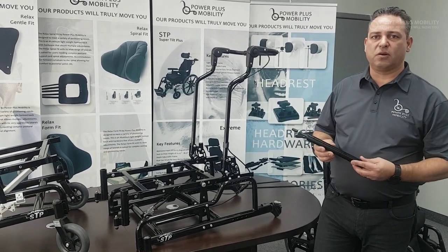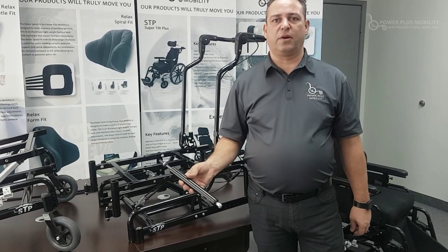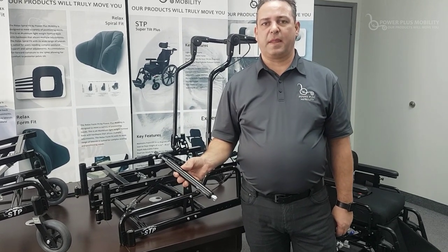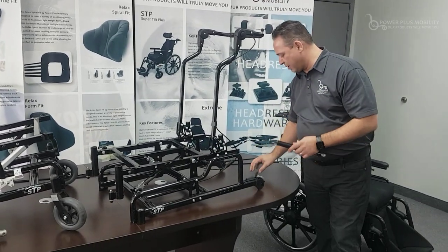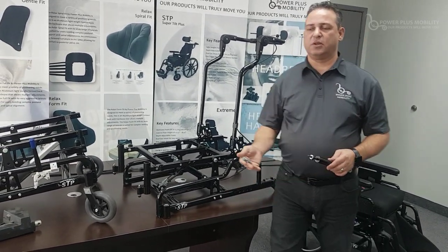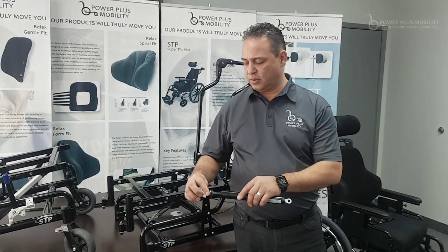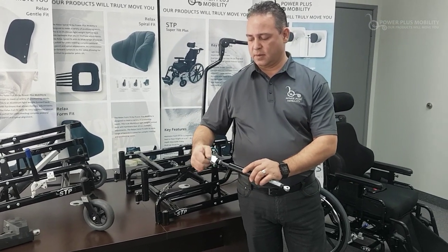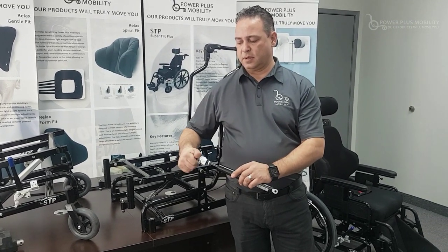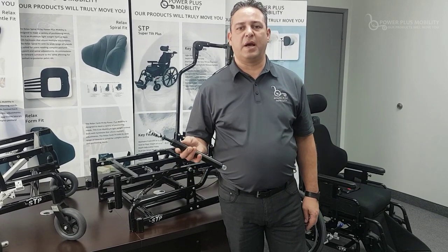Let's take a look at what a cylinder looks like. This is a typical cylinder that we use, and on the cylinder we have a very critical component called the cylinder head. The cylinder head attaches to the cylinder on one side, and once those two components are attached, we mount it to the chair.